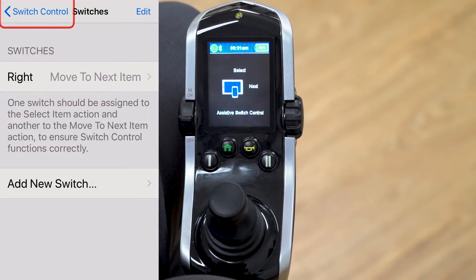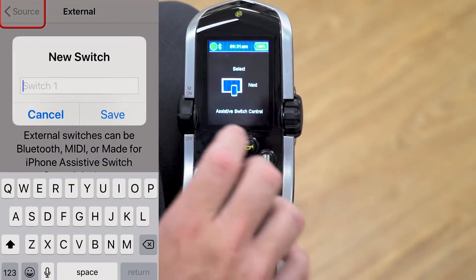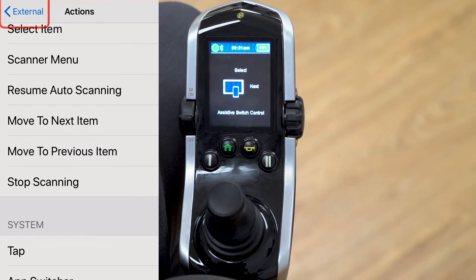Now add another directional command. Click add a new switch, choose external, give a left command on the joystick, and name it 'left.' Save it, then assign its function as move to previous.